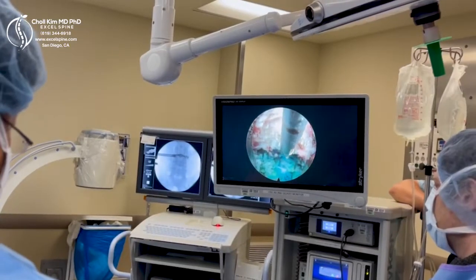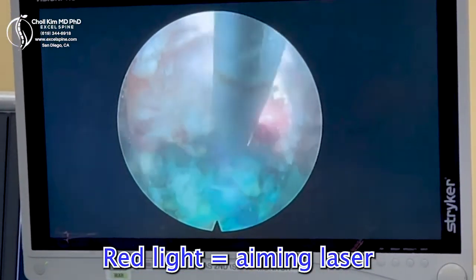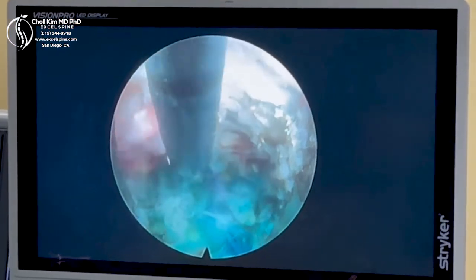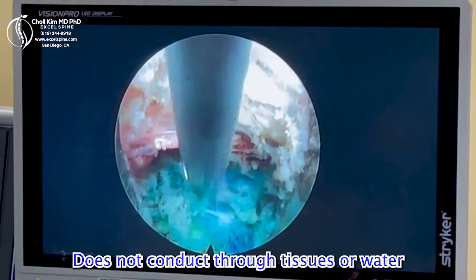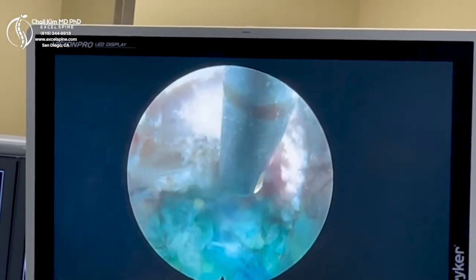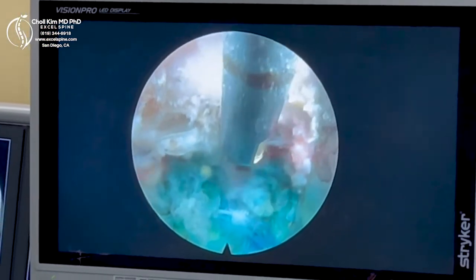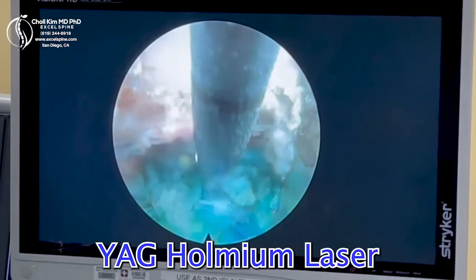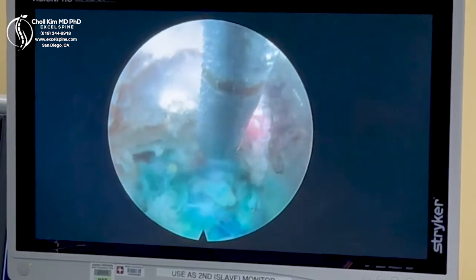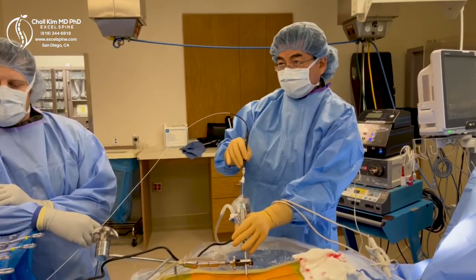Okay, now I'm using the laser right here — it fires sideways. That red light is not the actual working laser, it's just the guiding laser. And believe it or not, it's non-electrical. This laser is mechanical energy, photon energy. I don't know exactly what that means, but it doesn't conduct through tissues and water like an electrical current does. So the only way it can hurt the nerve is if I put that laser right on it — and unless I'm not paying attention or I don't recognize a nerve is there, it's impossible to do, because that red aiming laser tells me exactly where the working laser will work. It's a YAG holmium laser if you want to look that up. You can see how effective this is — the only problem is it's very expensive, but it's worth it, so I can say the word laser.